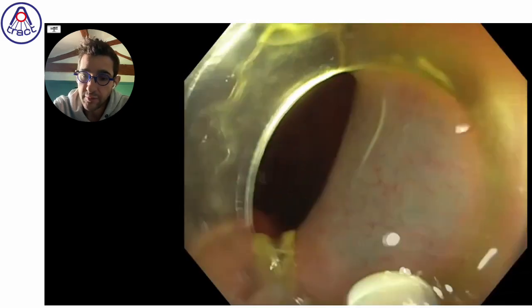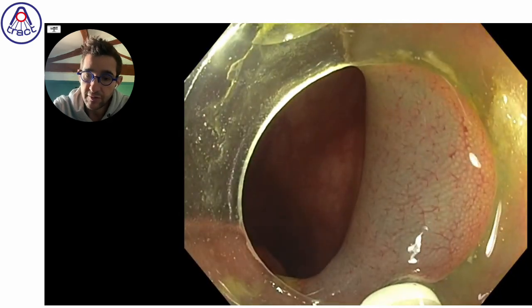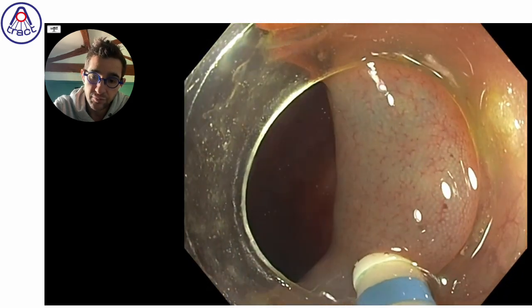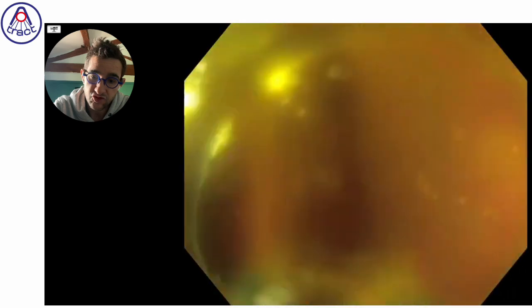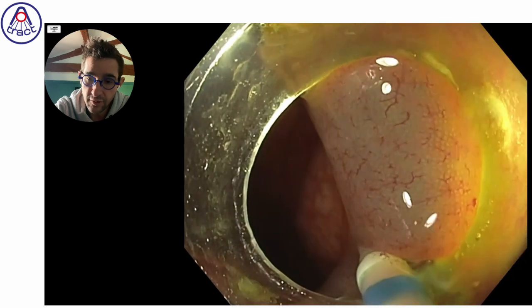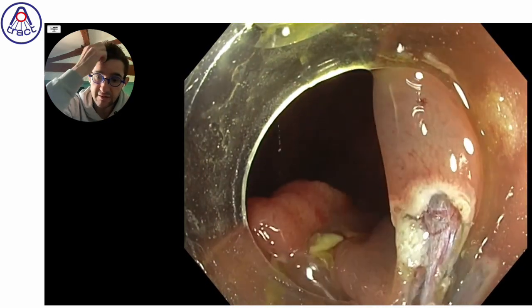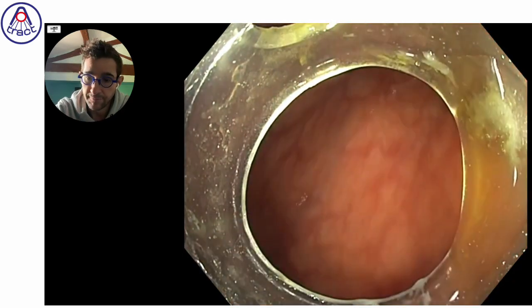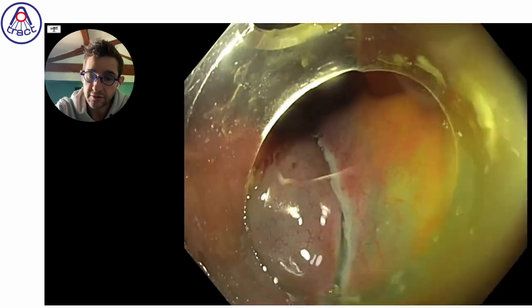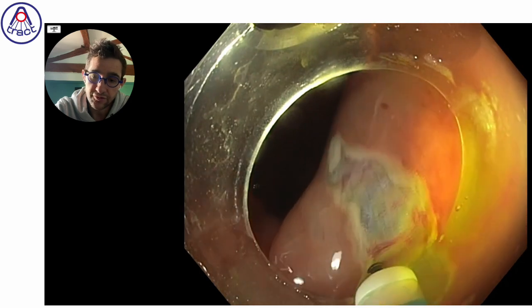and therefore you will see we will have to use adaptation, I mean a more difficult maneuver of the scope in order to complete the incision of the left side. So I did this incision here. It's somewhat difficult to go downhill. Usually it's more difficult to do an incision by descending than ascending, because the scope maneuverability to go up is better than to go down. But nevertheless, it was feasible here to join the two different incisions.